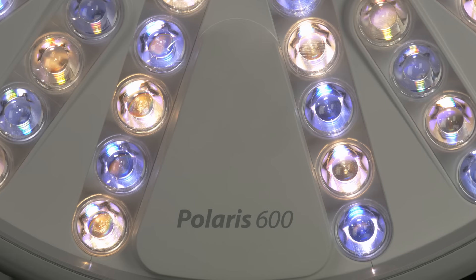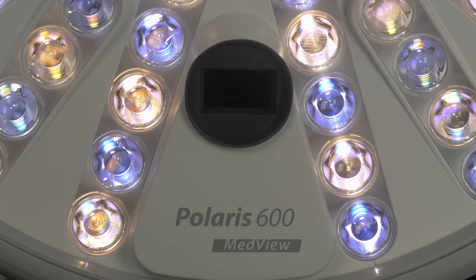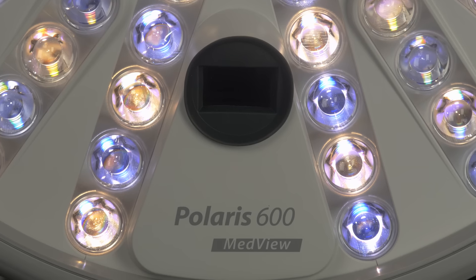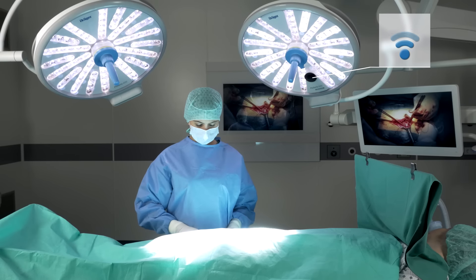The Polaris 600 can be optionally equipped with a high-quality HD camera, which can be retrofitted to the light head peripherally. The video signal is carried wirelessly to every area of the operating theater you wish.